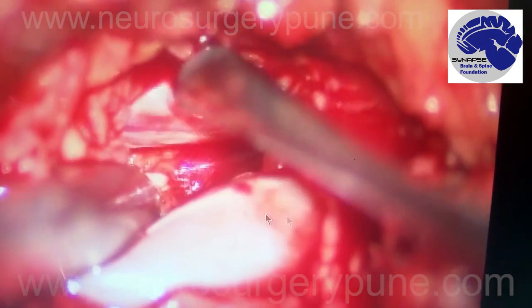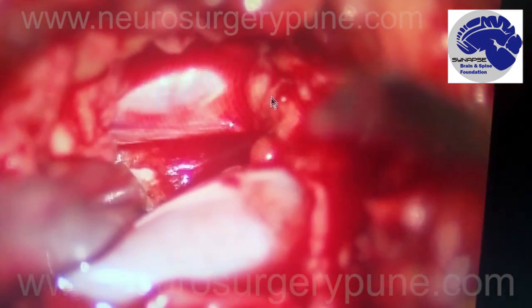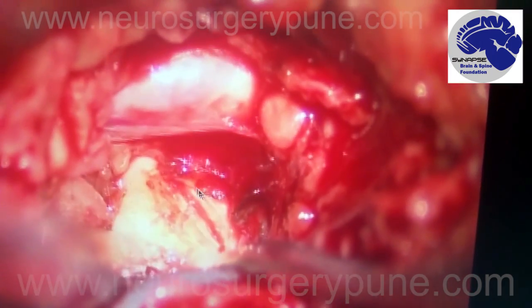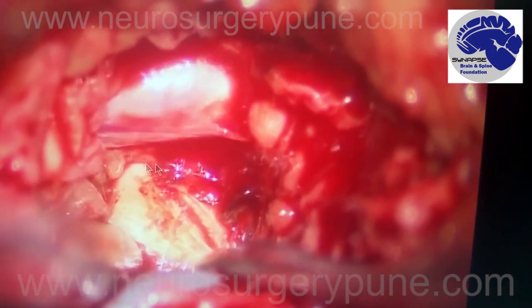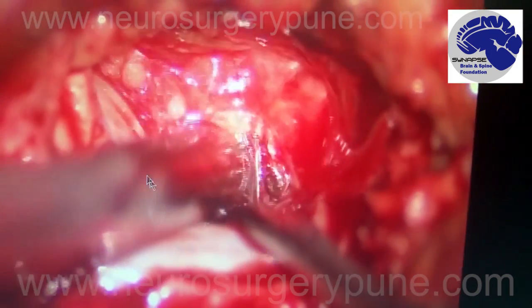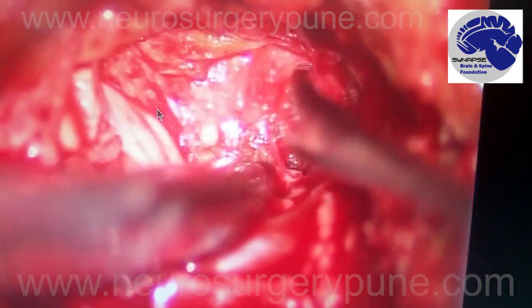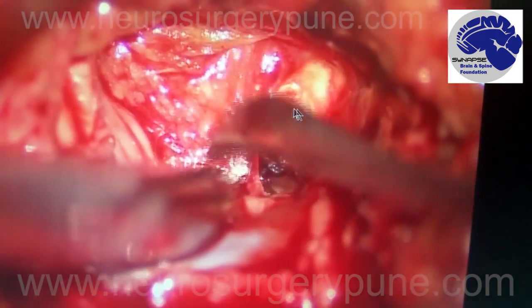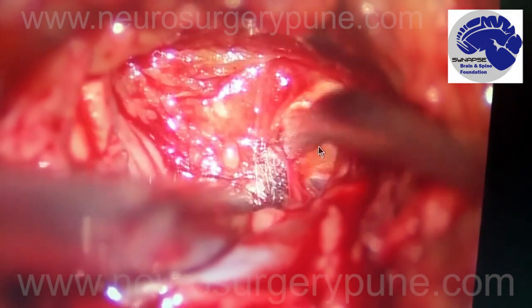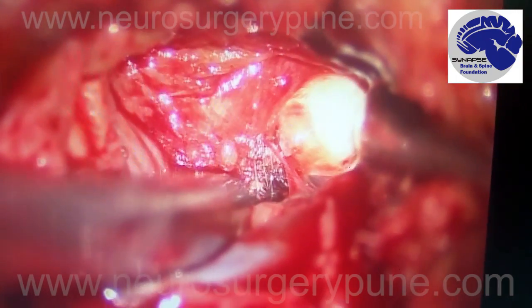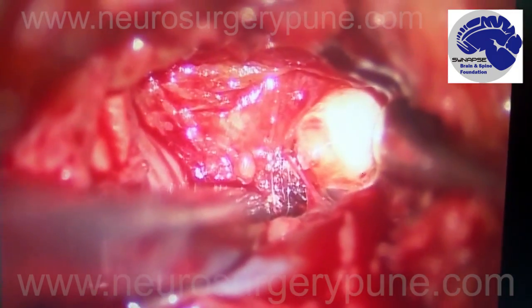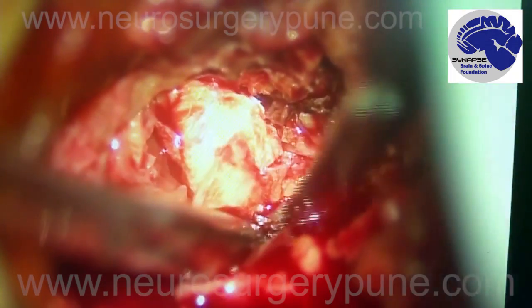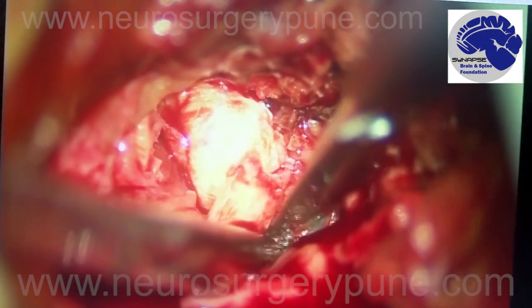This is the nerve root which is compressed — the nerve root of the left side if you look at the black arrow — and this is the disc which has come out and was severely compressing the nerve. This is another part of the disc, a nubbing which also was compressing the nerve, and we will be shortly removing this disc with the help of rongeurs.